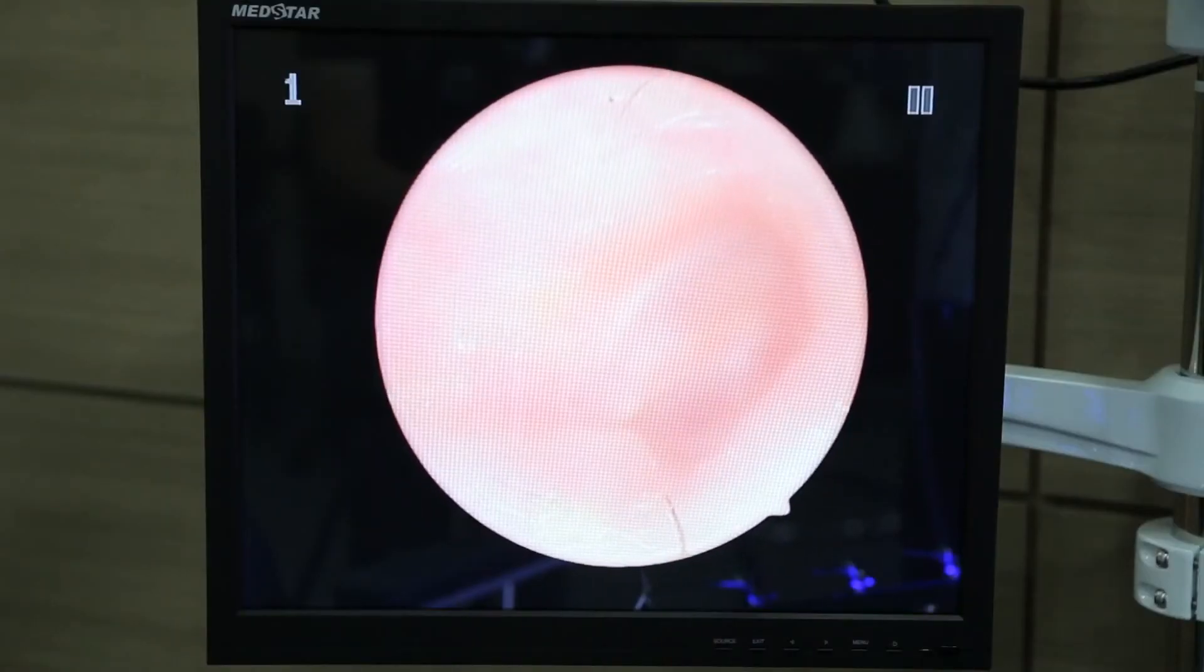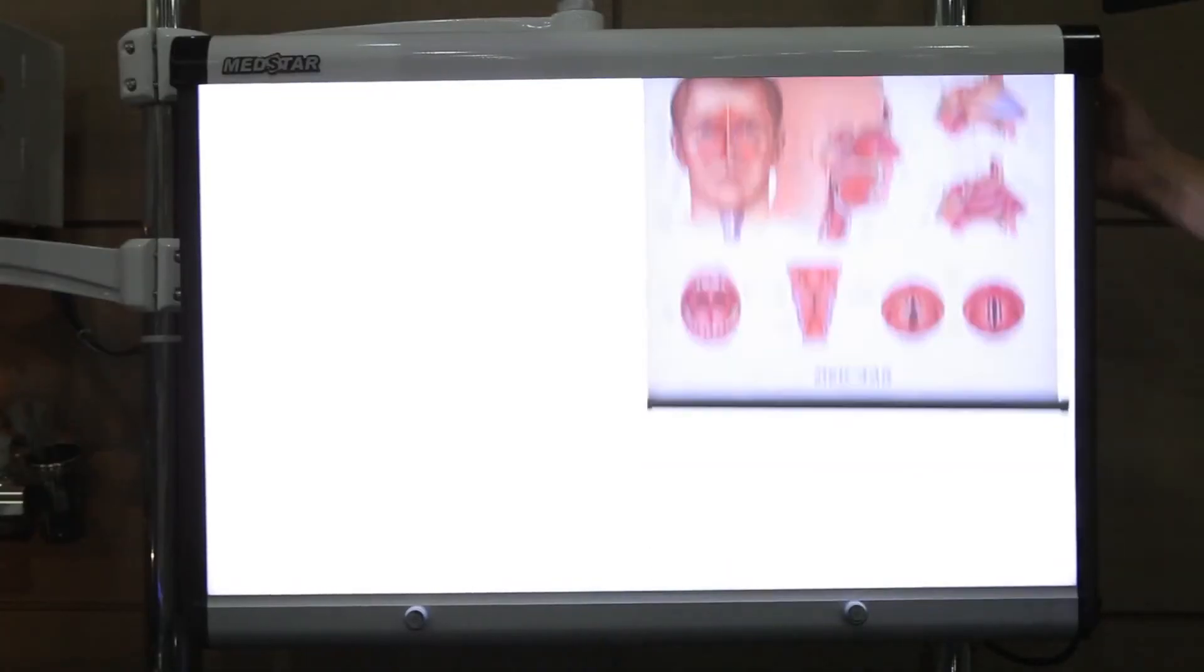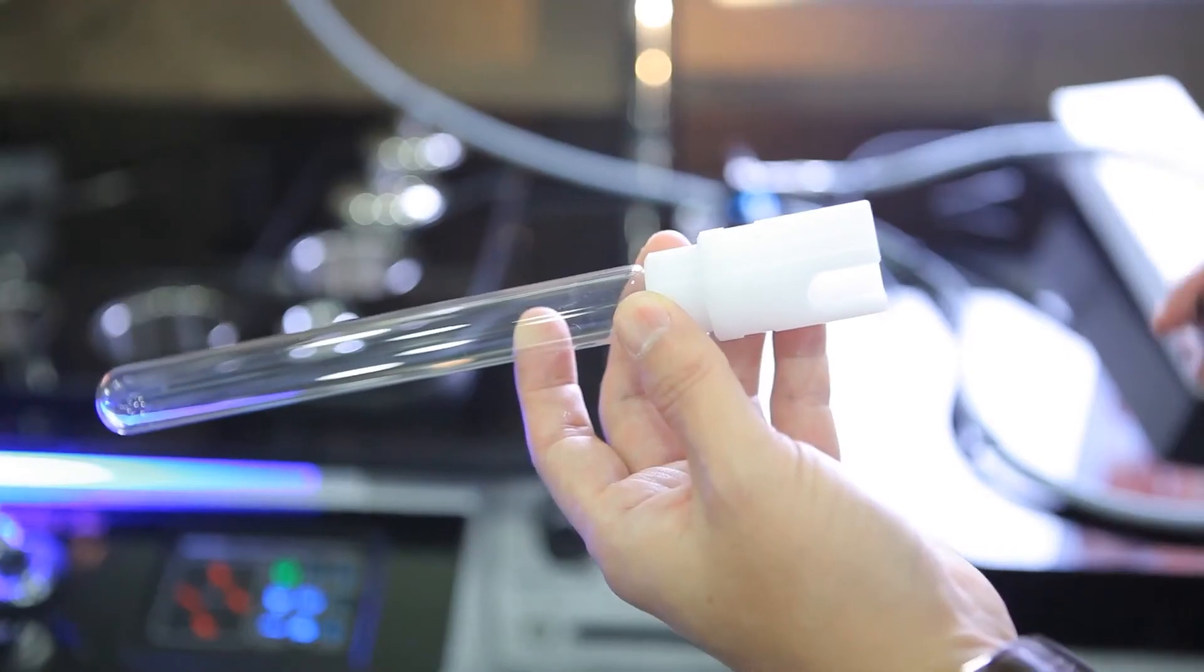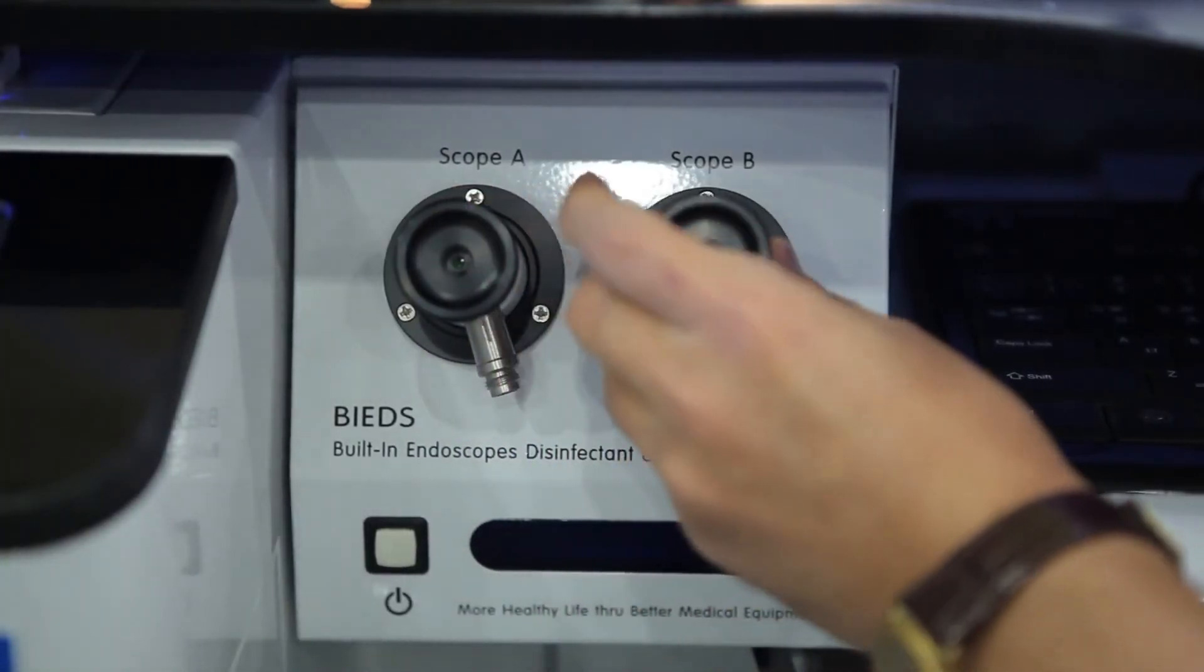It comes with a high definition endoscopic display, a clear microscopic display, and an impressively clean view box. It also comes with a built-in endoscope holder, UV sterilizer, and can be PC installed.